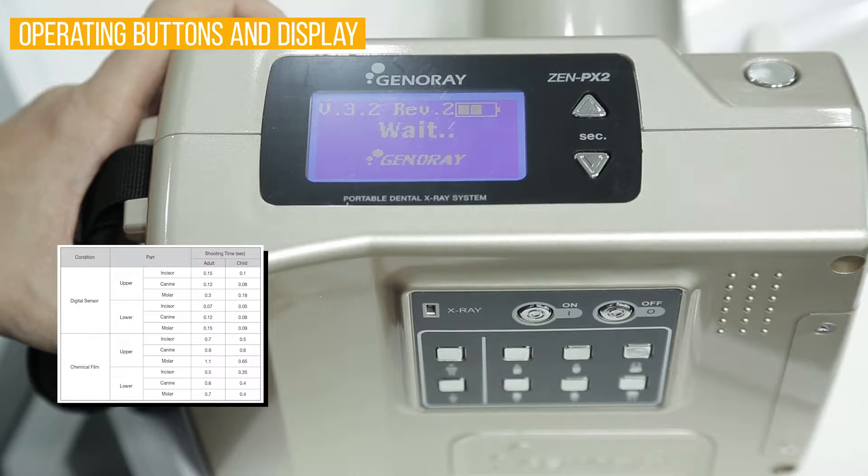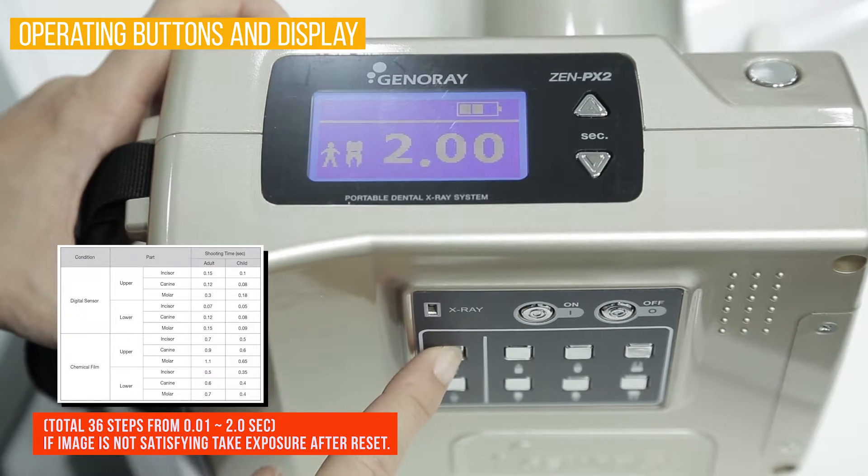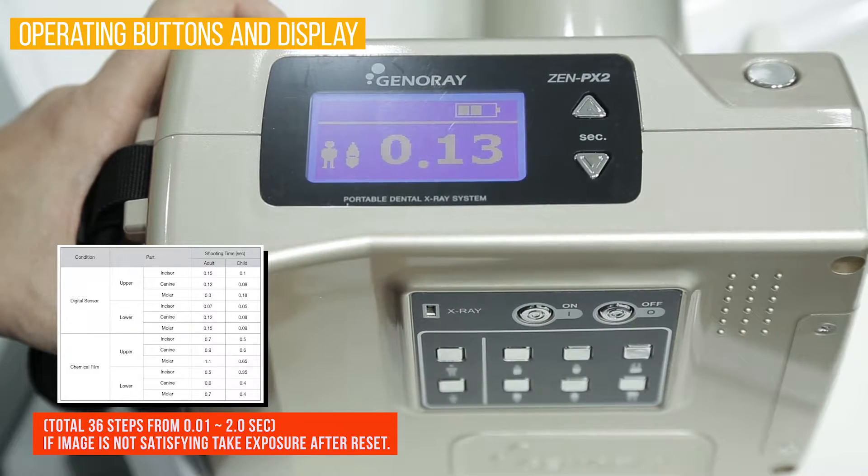Check original setting for manual and set exposure time. You can produce the best image by operating the exposure time button, due to the fact that many differences do occur depending on the type of patient and sensor you are using.